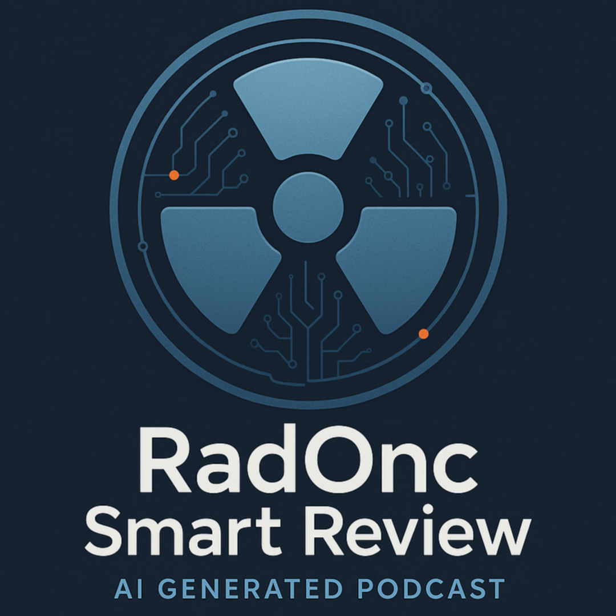Think of it like a regular diagnostic CT or a PET-CT dose. 1 to 5 centigray for kV CBCT, and the MV version, megavoltage cone beam CT, MV CBCT, using the treatment beam, significantly higher dose, often around 20 centigray per scan. And the image quality is generally worse than kV CBCT because of Compton scatter blurring things out. 20 centigray, wow. Okay, so kV port 0.1 centigray, kV CBCT 1 to 5 centigray, MV CBCT 20 centigray. Got it. High yield numbers.